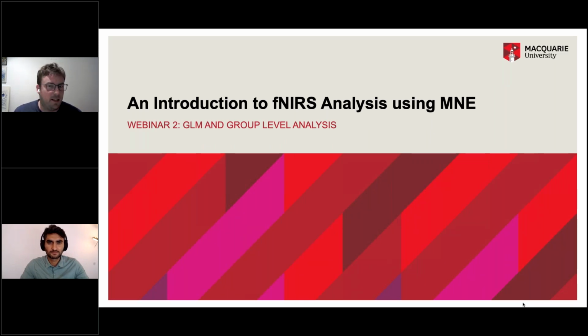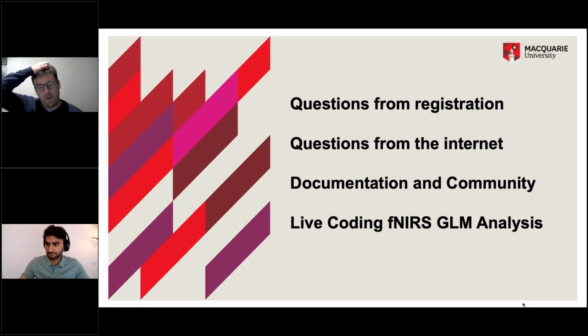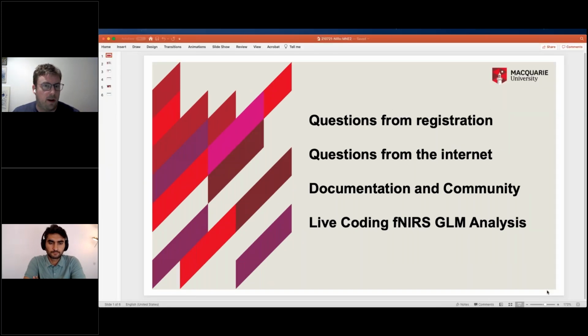This is the second webinar, and we'll follow a similar format to the first one. We'll start with some questions, and then we'll take a quick look at the documentation and how you can get help, and then we'll move on to an actual GLM analysis. I'll go out of full screen mode.